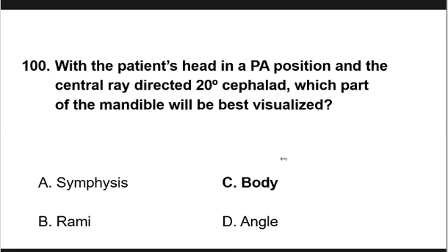Pag axial projections, pag PA po parati, caudad. Then pag AP parati cephalad. Majority, most of the time. Most of the projections, pag axial, pag PA, caudad ang angulation. Natataon lang siguro pero not all the time.